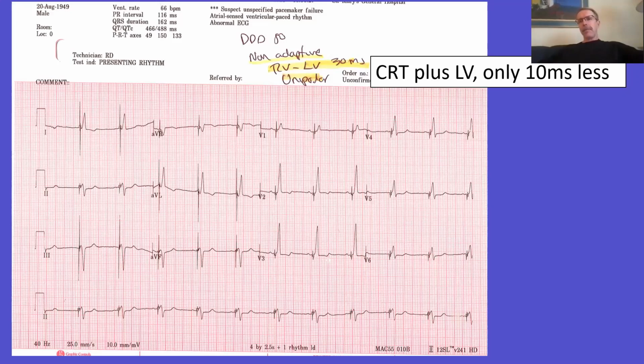It made me wonder, we're doing all these CRTs. Well, that's the next question, I guess, some study one day for this. But yeah, it didn't really make much difference. The interesting one was just the unipolar to bipolar. So I don't know if everybody just thinks maybe I wasn't quite deep enough, eh?